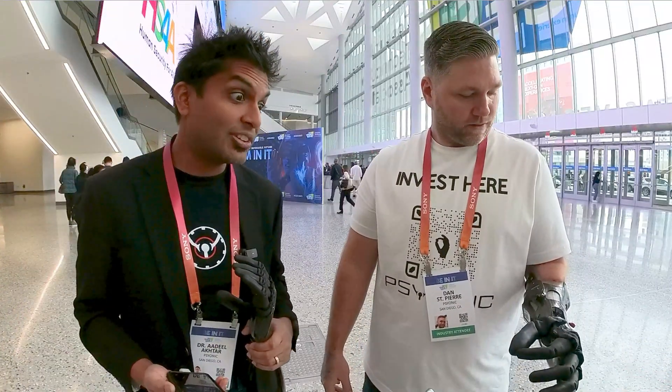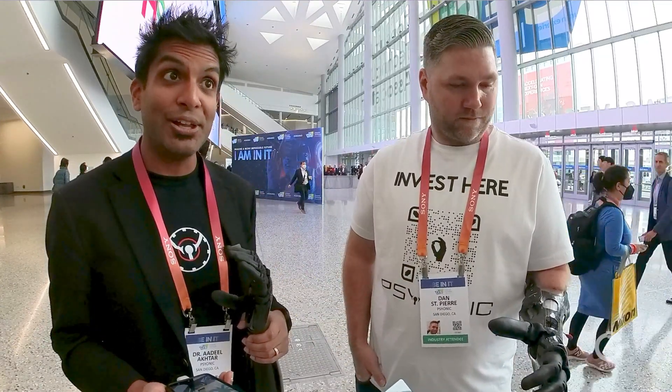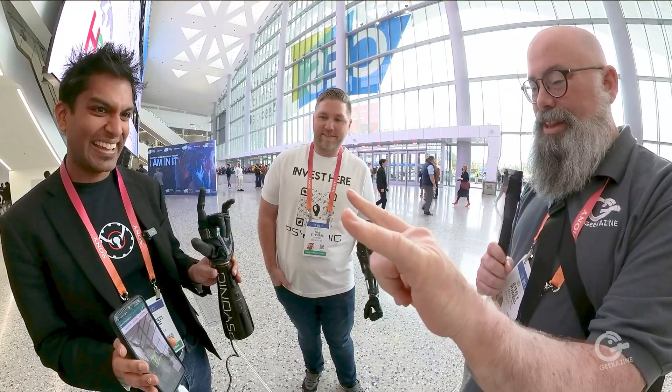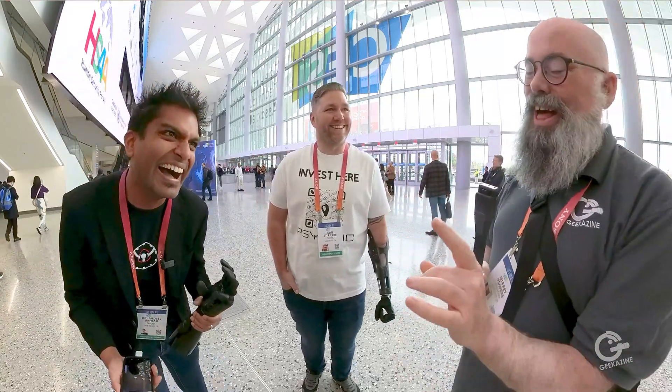What generation is this? This is actually the ninth generation of the hand over the last seven years. And if you want to try controlling it yourself, put your left hand in the camera — let's track your hand. Now make a fist. It's going to follow your finger movements. That's amazing!